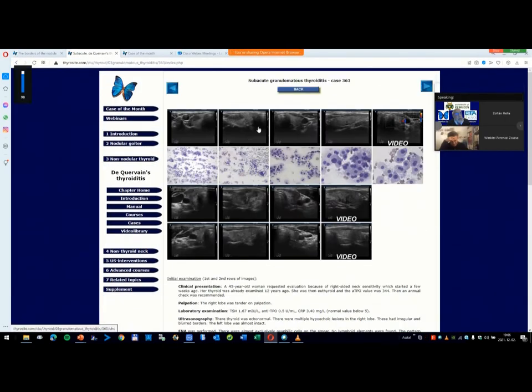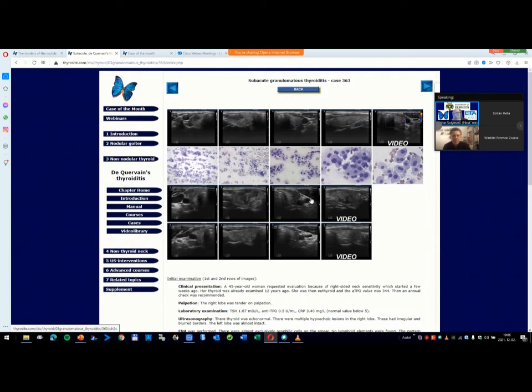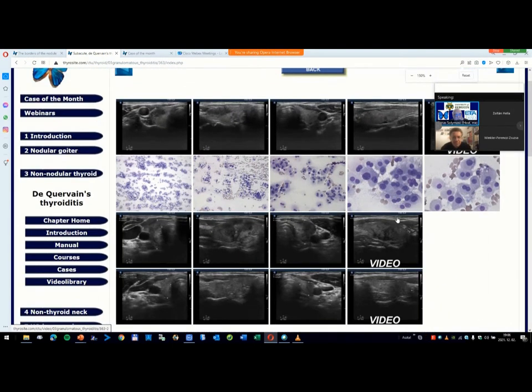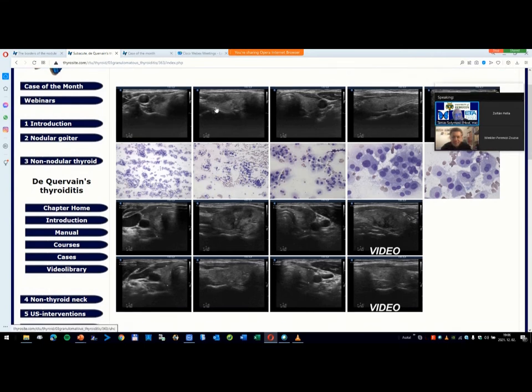Now you see around 12 images. I enlarge this view to compare the different time points. This was the first examination which was presented in the video: the right lobe transverse and longitudinal scan, and the intact left lobe.